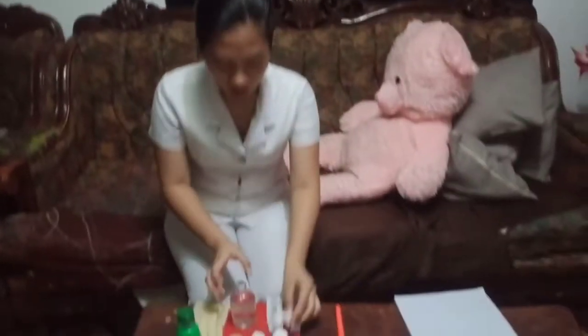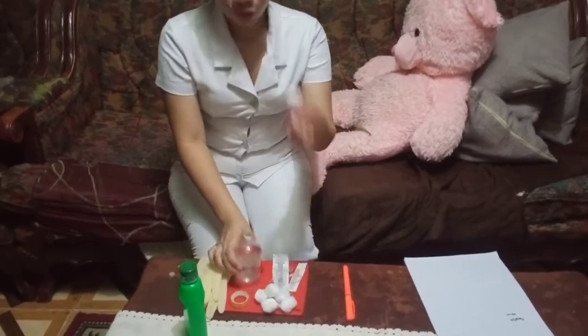Then remove the protective cap, or clean the rubber cap of a previously opened vial with an antiseptic wipe by rubbing in a circular motion so as not to contaminate it. Since it's open, we have to close it.